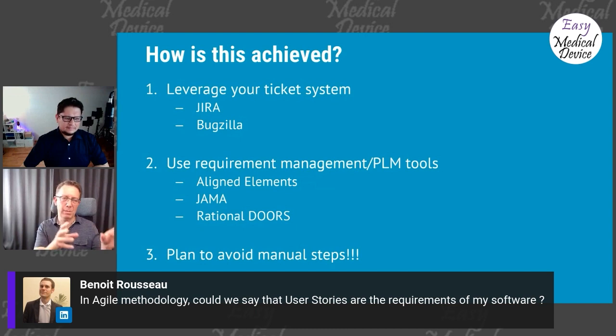If you look at what a requirement should be, it should be easy to understand, testable, and unambiguous. So if you define an appropriate number of tests for it, I would say it would probably fly as a requirement.